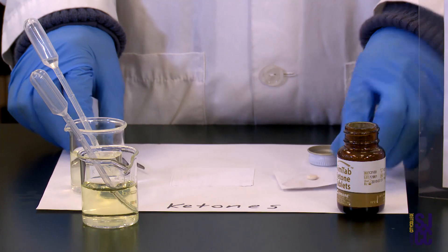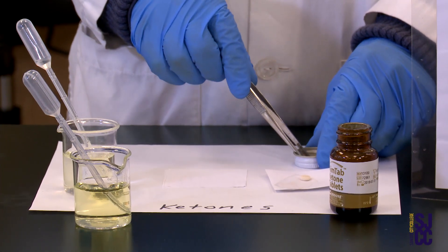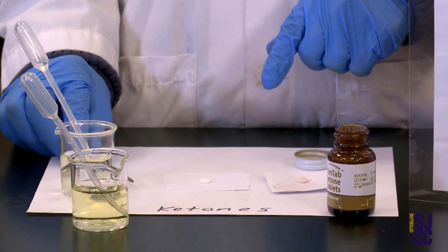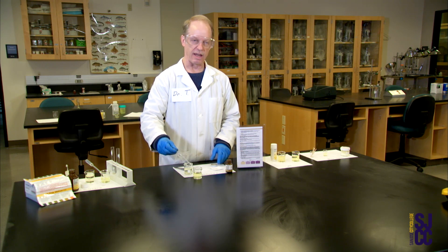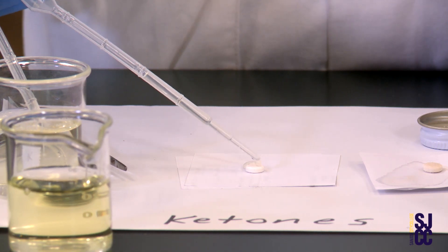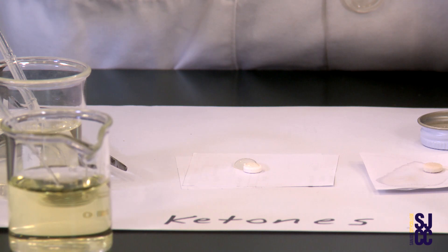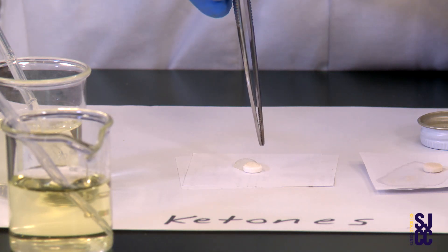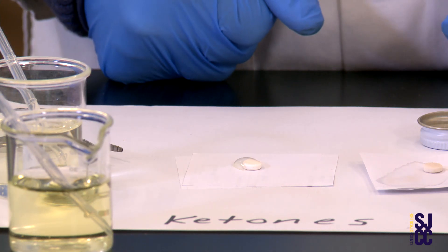This is sort of based on the concept of 'if the mountain won't come to Muhammad.' I take one of these tablets with forceps, move it over onto this piece of paper, and release it. Then I take my first urine sample, get some urine into the dropper, bring it over to where the tablet is sitting, and put one or two drops on top of that tablet. I want to be sure it's good and wet.